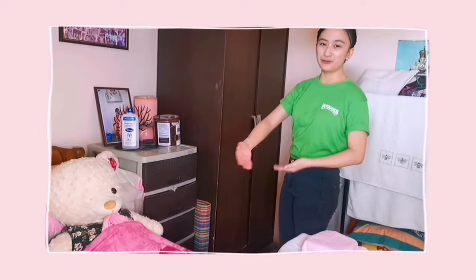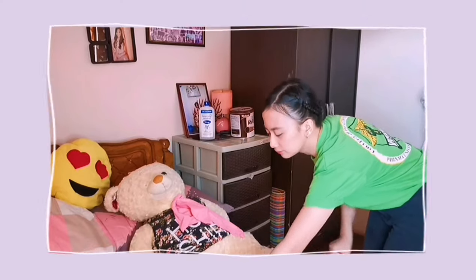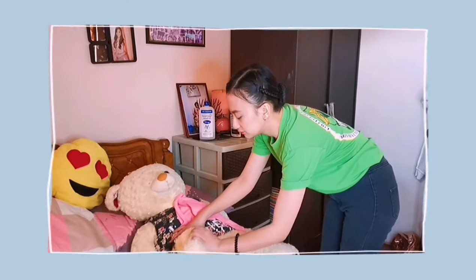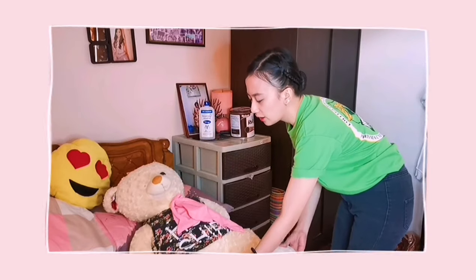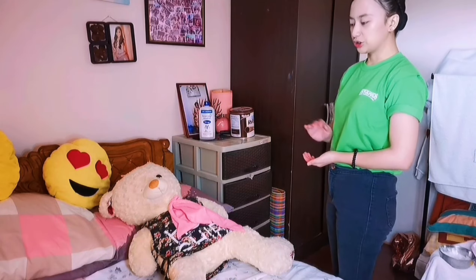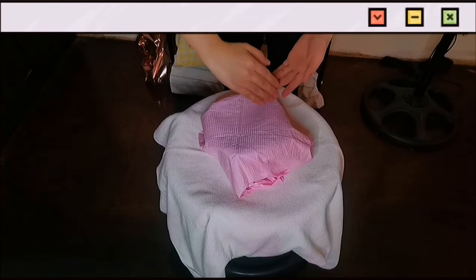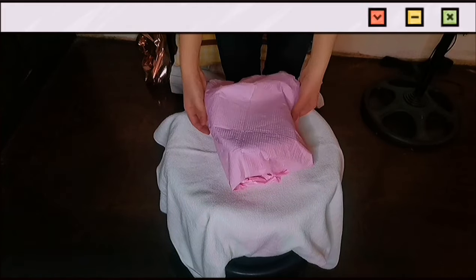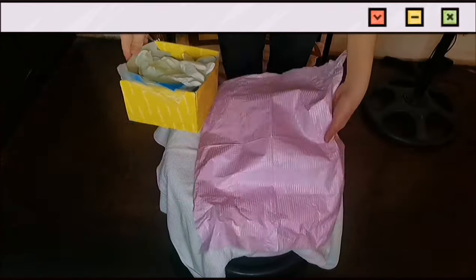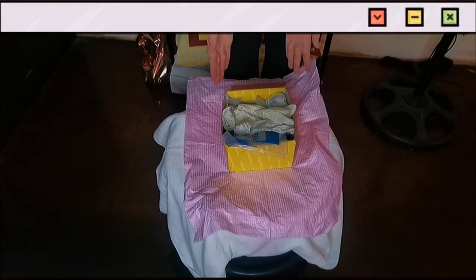Assuming that I already put the bed at my working height to avoid backaches. Next I will roll down the blanket and position the patient into a dorsal recumbent, knee-flex position. Assuming that she is already in position with her feet two feet apart. It must have good lighting and a good position for the patient. Assuming that this is a sterile kit — the correct way to open it is away from us, to the side, and then towards us. Remember that the border is not sterile; the inside is sterile.